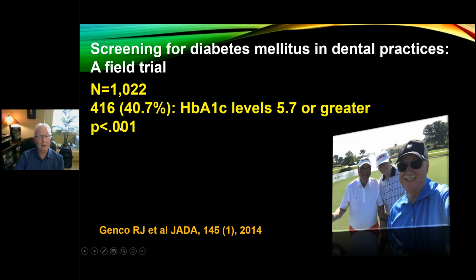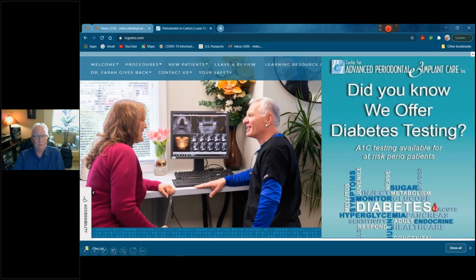So, at a high probability. The deal is, here's one of my friends. He doesn't know I'm actually showing this image. This is Constantine Farah up in Canton, Ohio. And I would be making these suggestions in my reports. Patients should be referred to their primary care provider for evaluation of hypertension and stroke risk, as well as undiagnosed type 2 diabetes mellitus. And then I'd say clinical evaluation or serologic evaluation should include serologic levels of hemoglobin A1C. And I called him up to say that to him one day, and he said, well, I already do that, Dale. I said, what? He said, yes, I do that testing in my office.